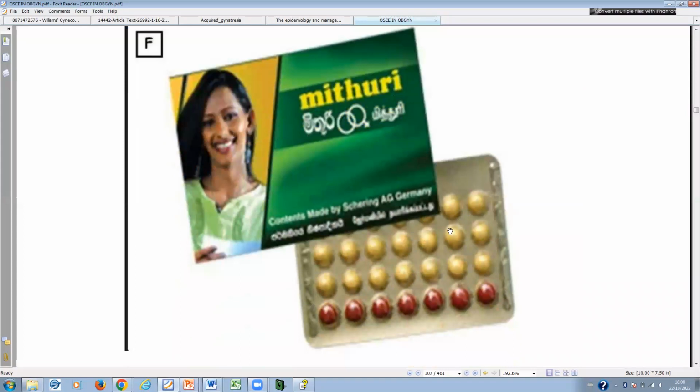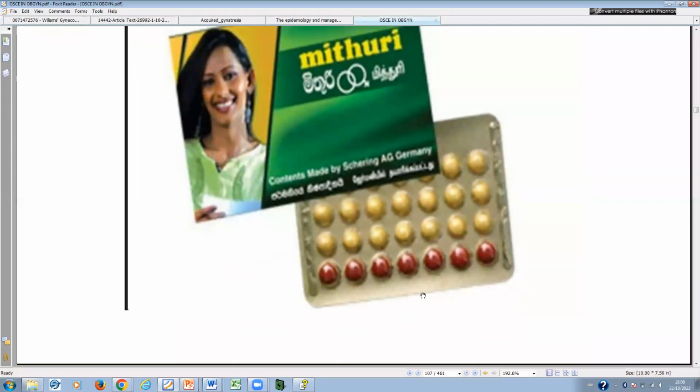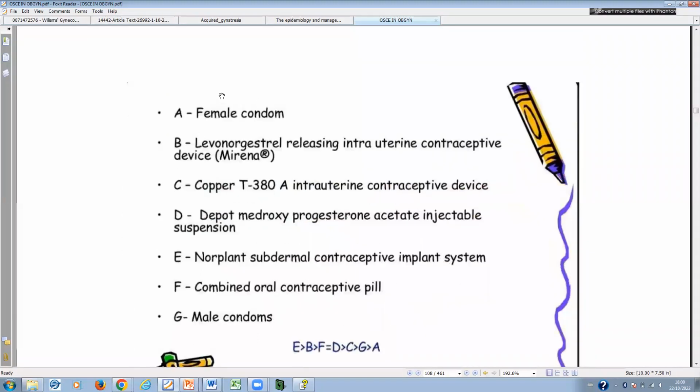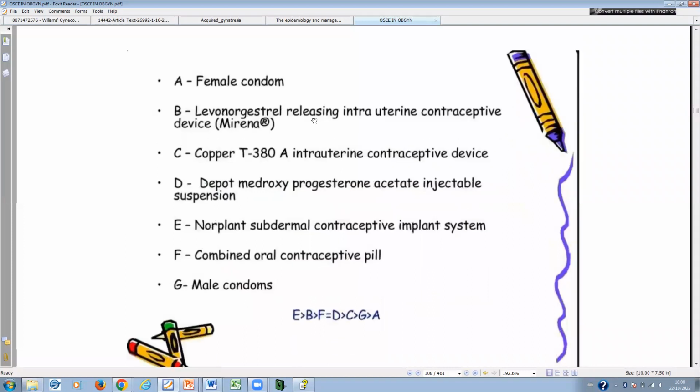And these are combined oral contraceptive pills. They contain 21 active pills, while the 7 are placebo. It's a form of oral contraceptive pills, so they can be asked. So all those structures that I showed earlier: A is the female condom, B is the levonorgestrel-releasing intrauterine system, Mirena. That is Mirena. Then also the copper, the combined contraceptive, and the male condom.